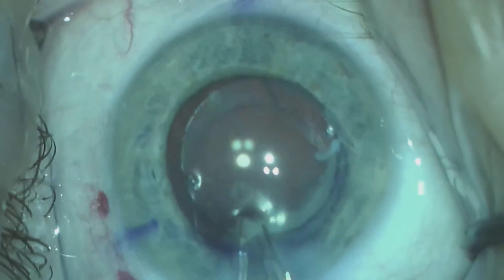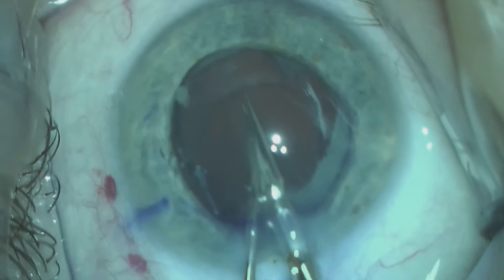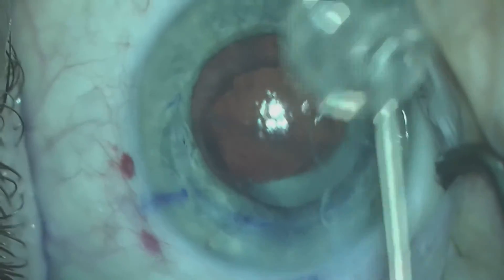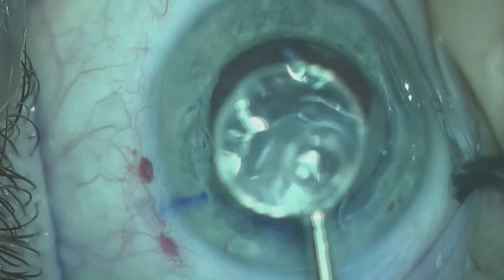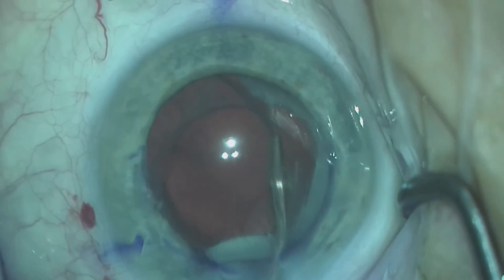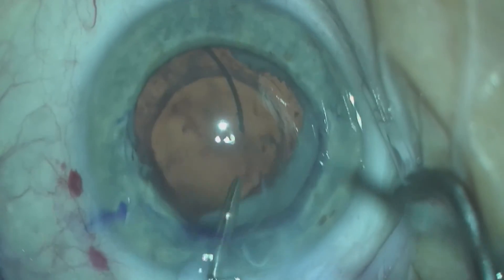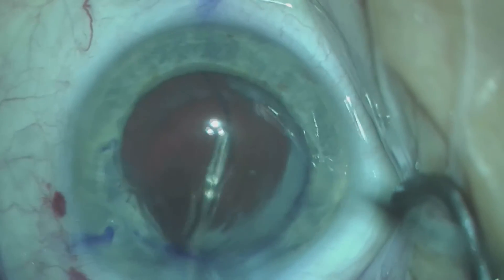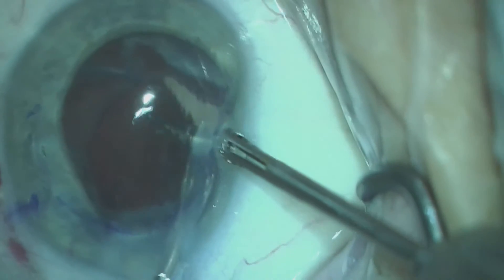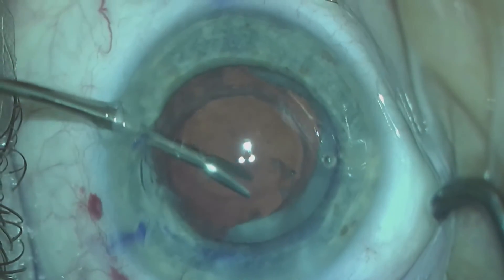At this point, I use a Pac-Man type technique to remove the lens from the eye using, once again, MST micro forceps and lens cutters. You can see the lens has now been removed and the remaining haptics are still present. We try to remove the haptic; however, some of the bag starts coming with it. So we decide to just trim this haptic and allow the remaining approximately 2 millimeters of haptic to stay in the bag.